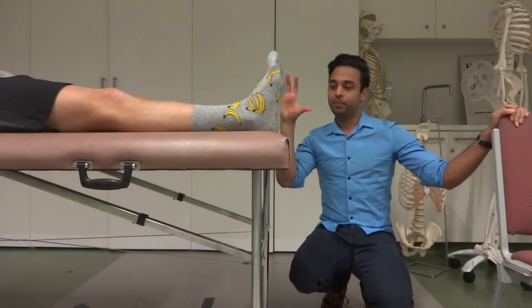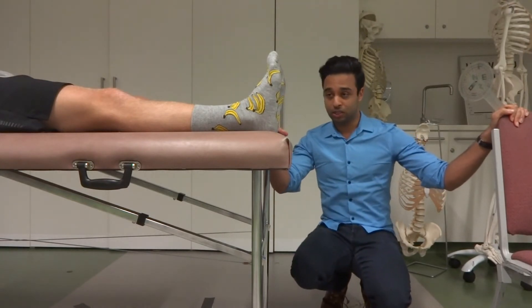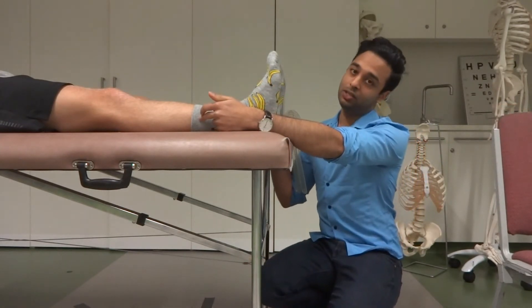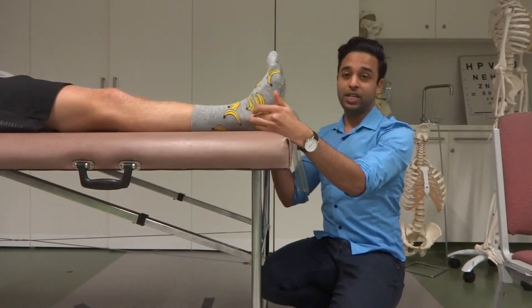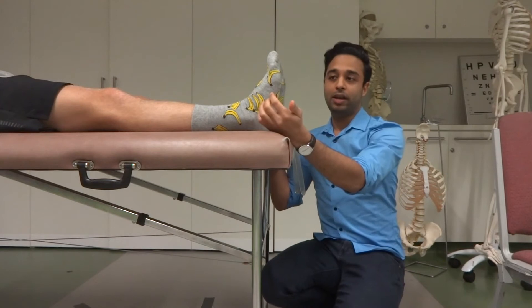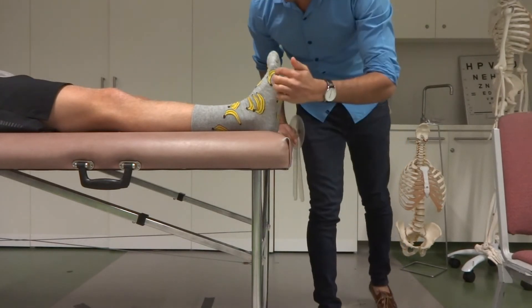The three landmarks we're going to use are going to be the same for both plantar flexion and dorsiflexion. The fixed arm is basically going to be along the axis of the lower leg, running alongside the fibula. The axis of rotation is the lateral malleolus. The movable arm is going to be parallel with the fifth metatarsal, which is this part here.